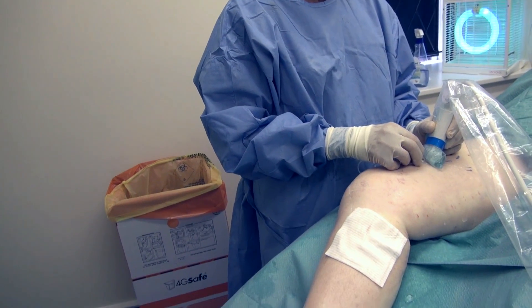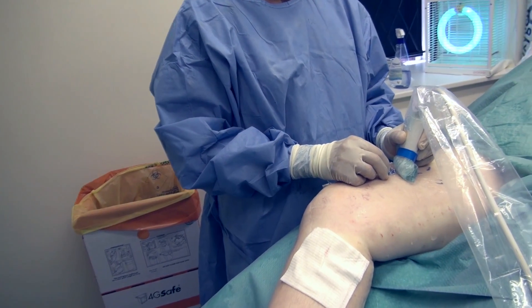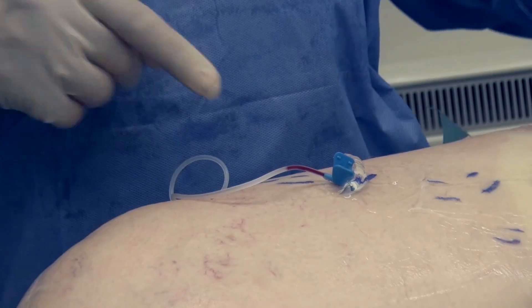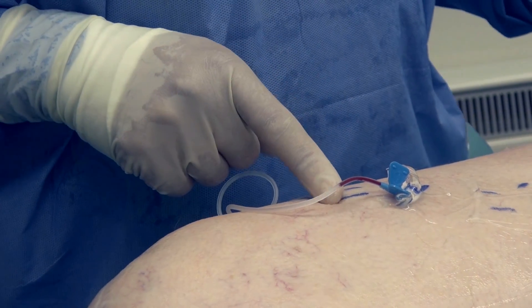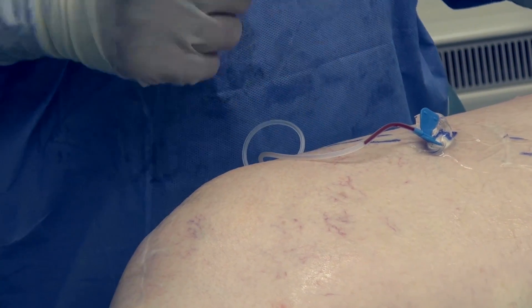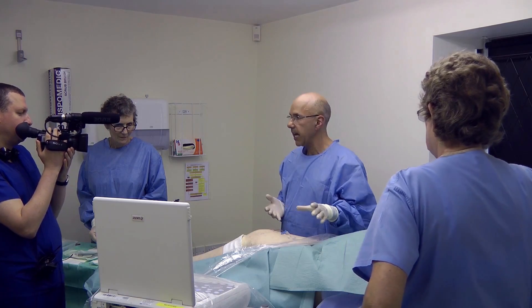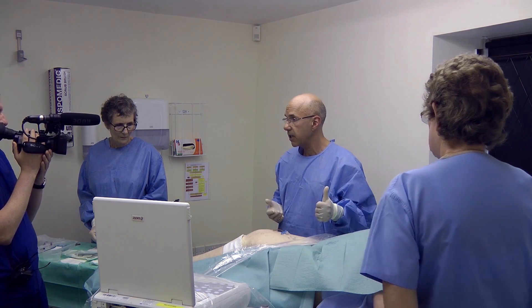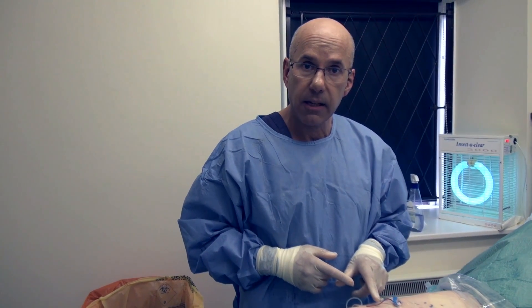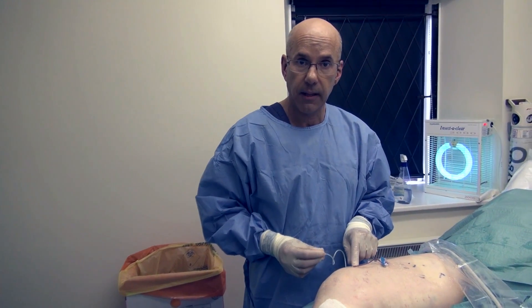It's a very fine needle and shouldn't cause too much discomfort. The vein we're cannulating is 2mm, and we have confirmation that we're in the vein by the very slow movement of dark blood. Three criteria for cannulation have been passed: criterion one, I've seen the tip of the cannula in the vein on ultrasound; criterion two, I've seen dark blood come back, suggesting we are in a vein; and criterion three, it's non-pulsatile, so we're not in an artery.